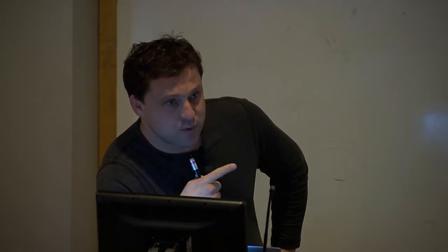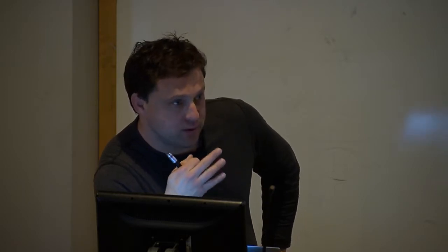But if you see this for like the 1000th time, you realize that you would be way better at this than she is. You'd be like, woof, woof, woof. But she's about as good as you would be without a somatosensory system. And so the idea is, if you want to restore the kind of dexterity that we are endowed with, you need not only to have these pretty sweet anthropomorphic robotic arms and control systems to actually move these arms volitionally, but you also need to restore the sensory system, and that's where we come in.